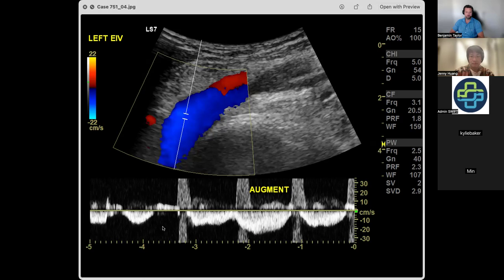You've then got, well, if I'm squeezing at the calf and there's a column of blood that's going up, but there's a thrombus between where I'm squeezing and where I'm measuring, I'm not going to see a big squirt. So maybe that's why I've lost augmentation, because that column of blood cannot transit up properly. And that can be because of obstruction between where you're applying the pressure and where you're measuring, or even if you've got a more upstream obstruction, it may still impede the flow of blood. So it's a really non-specific thing, but it tells me something's wrong somewhere.